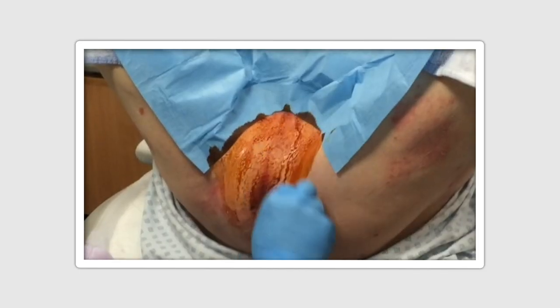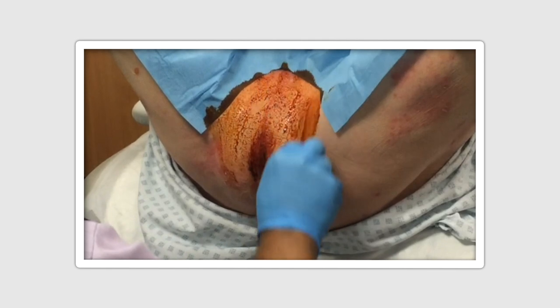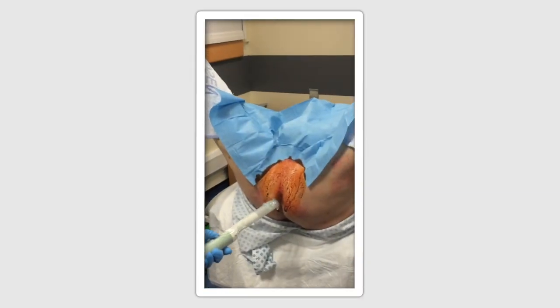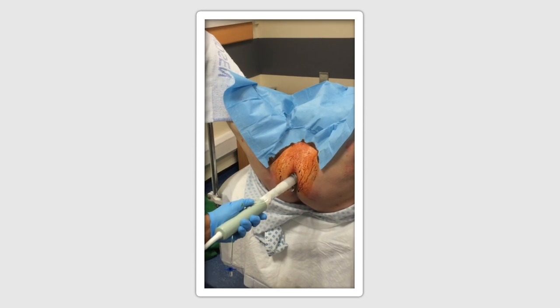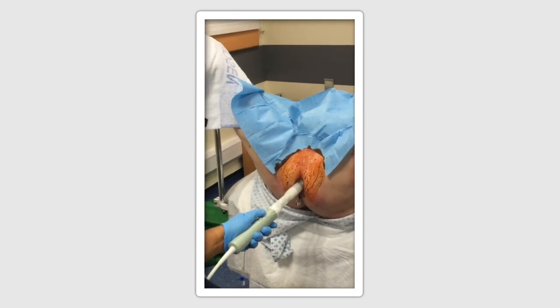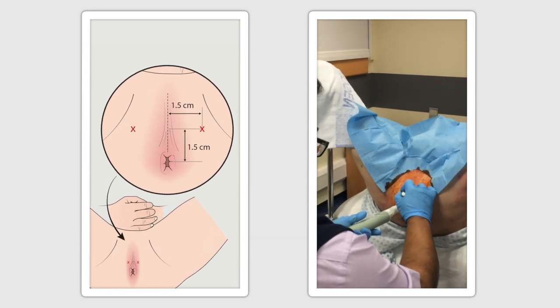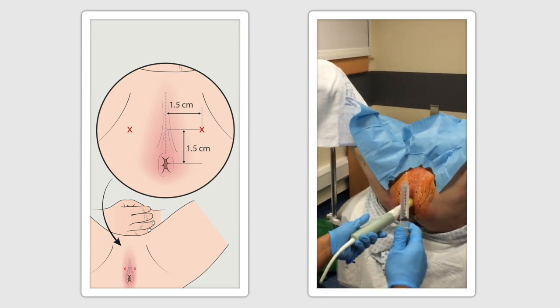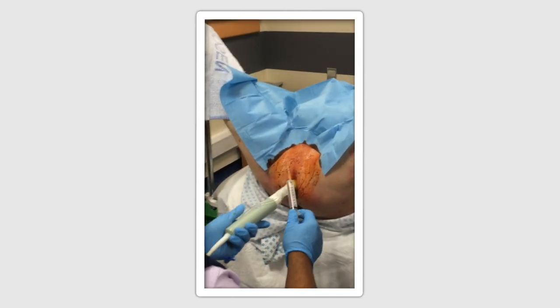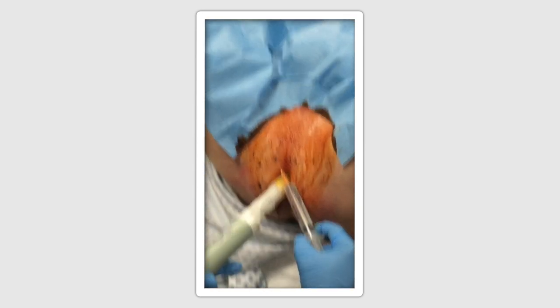The area is prepared with antiseptic wash, and a preliminary scan is performed using the linear transducer probe inserted into the rectum to visualise the prostate gland and the depth from the perineal surface. A point approximately 1.5cm up from the anal verge in the midline is marked, and 1.5cm to the right and left of this point laterally. Approximately 1ml of local anaesthesia is injected using the orange needle to numb the skin.